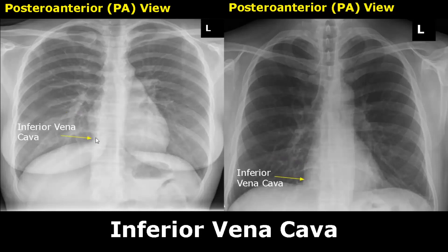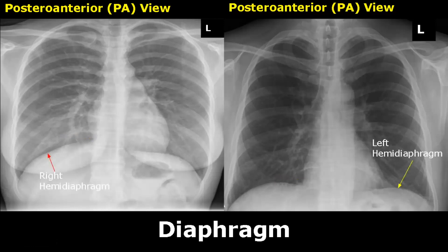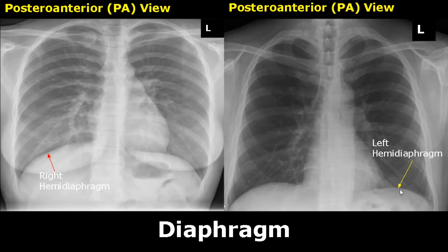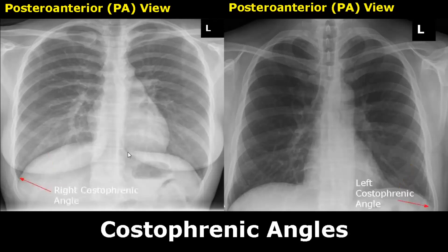This is the location of the inferior vena cava. It is seen at the lower margin of the right heart border. The diaphragm is very easily seen and is dome shaped. The right half of the diaphragm is called the right hemidiaphragm and the left half is the left hemidiaphragm. Here are the costophrenic angles, formed at the point where the chest wall meets the diaphragm.